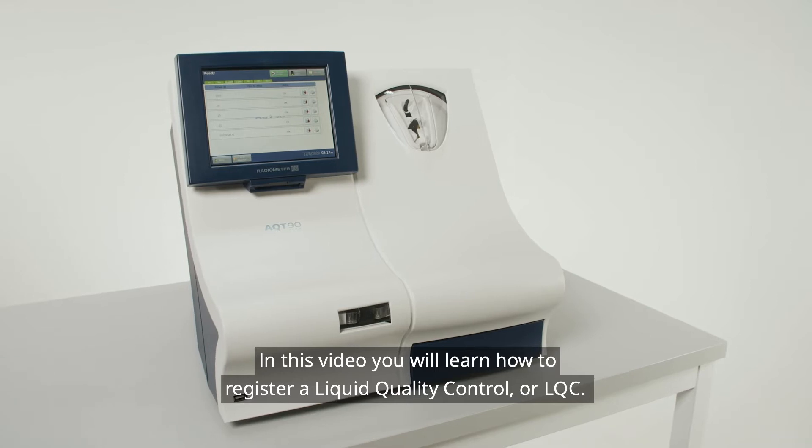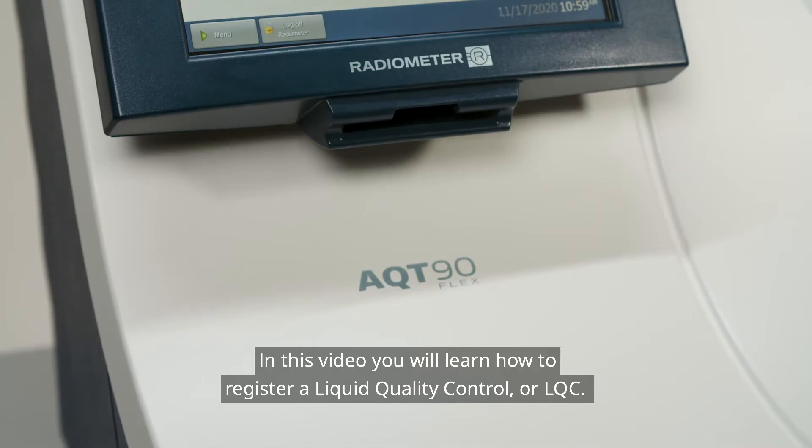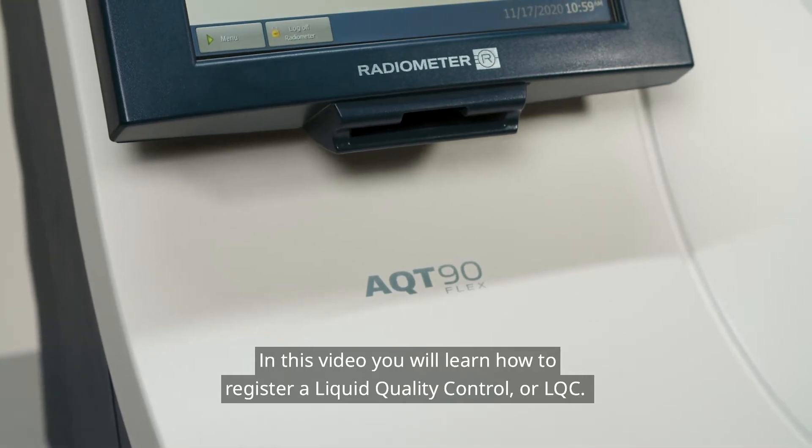In this video, you will learn how to register a Liquid Quality Control, or LQC.